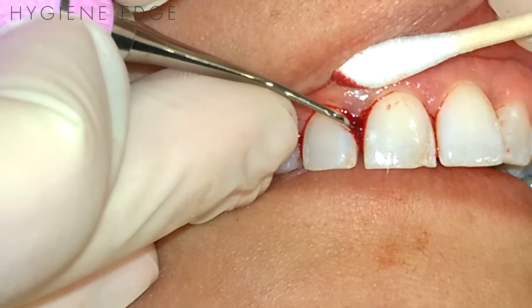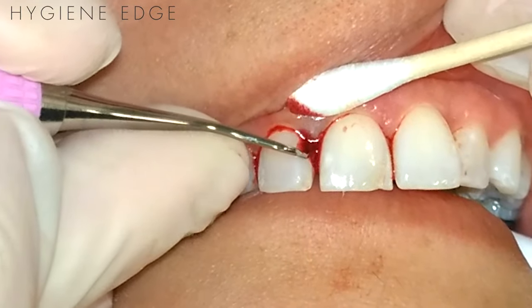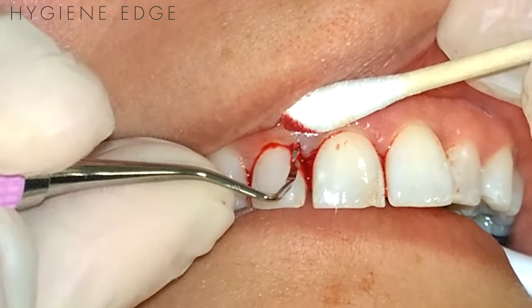Then support the sulcus wall with a cotton swab like so, and starting from the base, use 1mm overlapping strokes to lightly scrape the sulcus wall in a coronal direction.